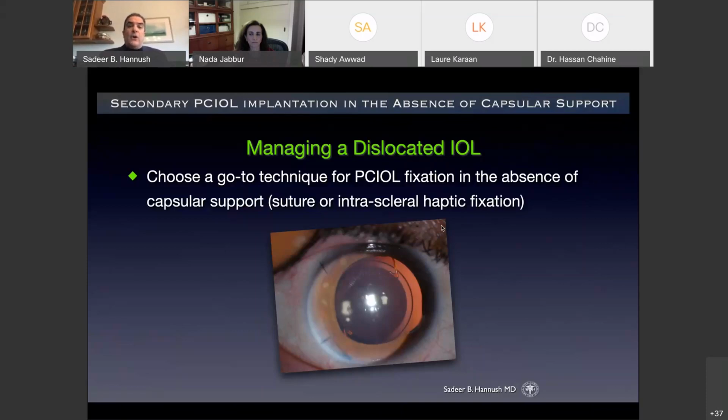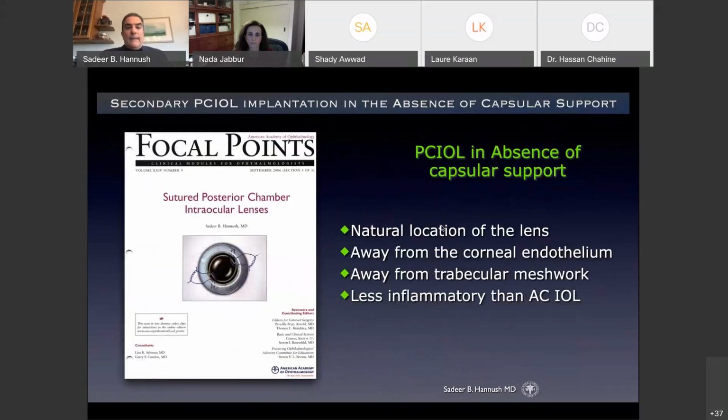The labeling on the 8-0 Gore-Tex from the company called Gore used to say specifically not for ophthalmic use, which is a medical legal problem in the US, but since 2018, they took it off the labeling. And it's still, all of this is practice of medicine. These sutures were not intended for ophthalmology. Okay? So I started sclerally fixating implants in 1988, immediately out of fellowship.